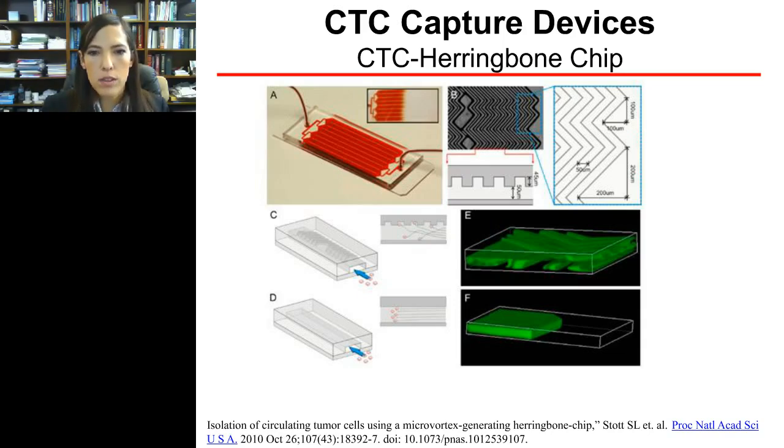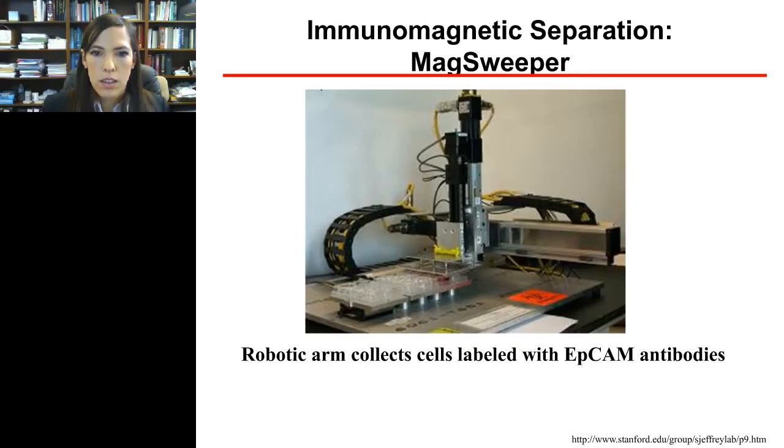And they've showed the ability to produce efficient capture of CTCs using this method. So I believe that we'll see more with this device.